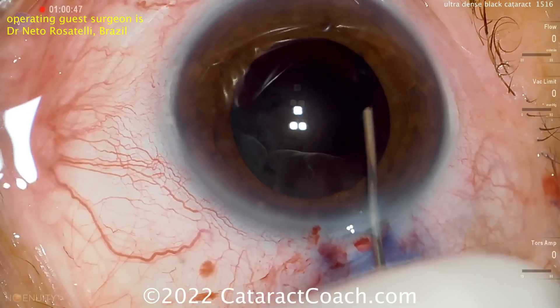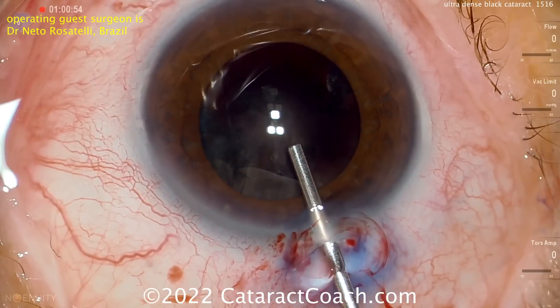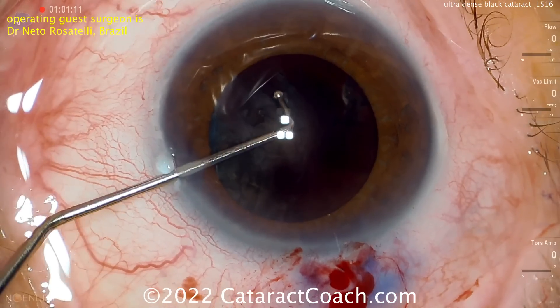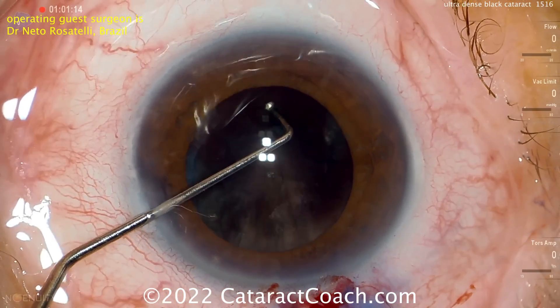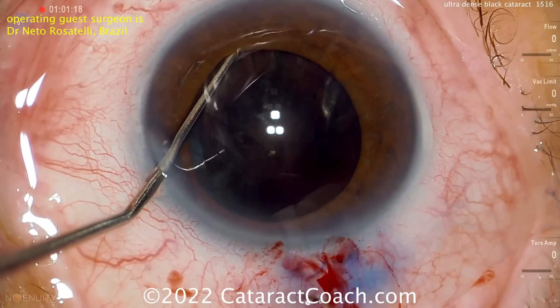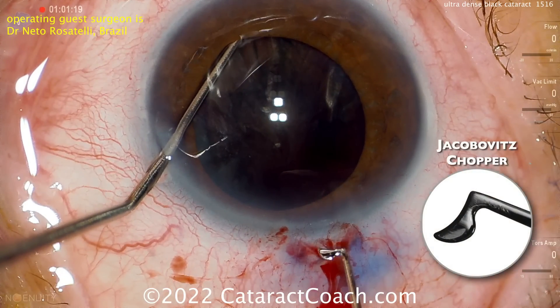Be cautious on the hydrodissection, because you're not going to be able to see a fluid wave — it's just such an opaque lens, there's really not much of a fluid wave. Now more viscoelastic going inside the eye. Here comes a chopper, or even just a hook to help hold the nucleus. The hook is there to hold the nucleus in place, and here's a sharp-edged chopper — that's the Jacobovitz chopper.